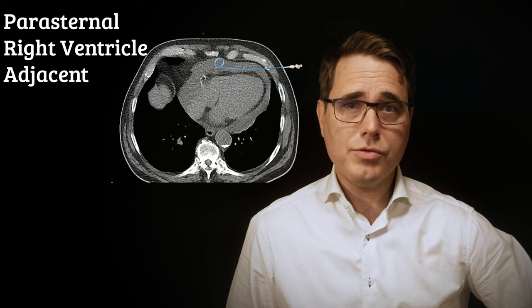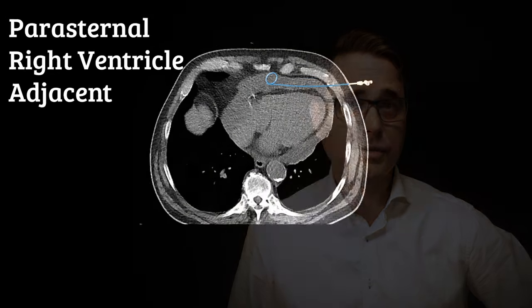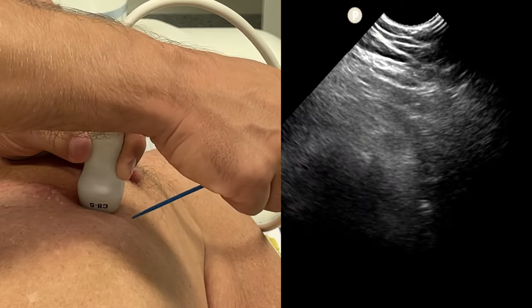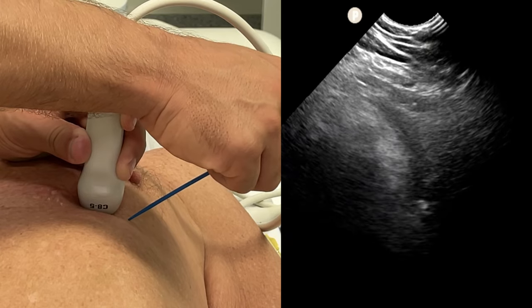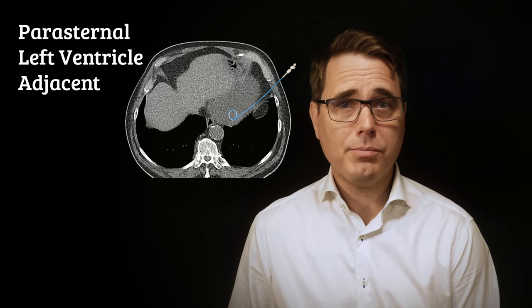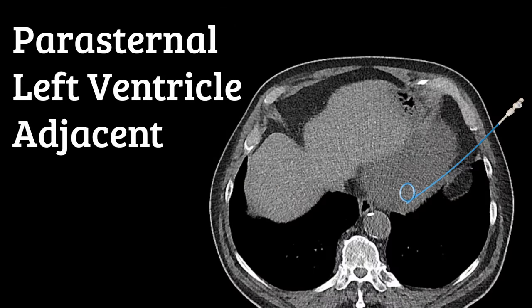A parasternal right ventricle-adjacent approach allows for a superficial needle path very parallel to the right ventricle. The tip of the pigtail will be positioned ventrally, and in immobilized patients this gives sub-optimal drainage. So this approach is mainly suitable for localized effusions or in emergencies like cardiac arrest. The parasternal left ventricle-adjacent approach is also parallel to the heart on the other side, adjacent to the left ventricle. Importantly, the drain tip will end up in the desired dorsal-caudal position. This will always be our first-hand choice.